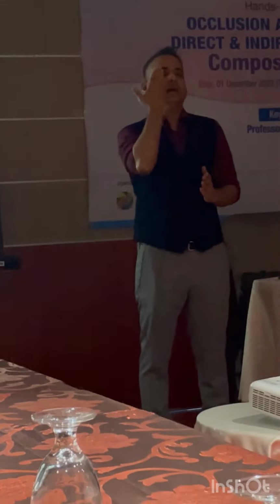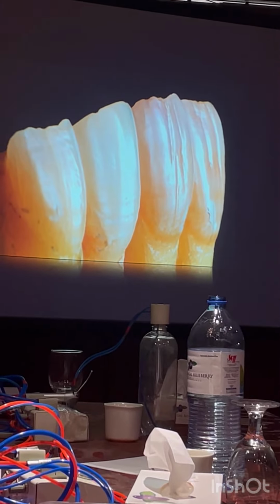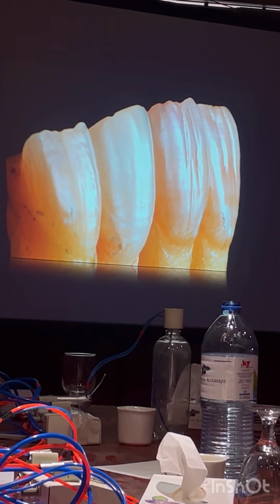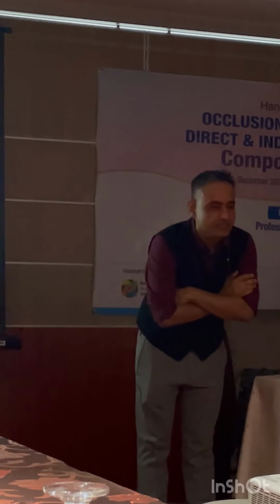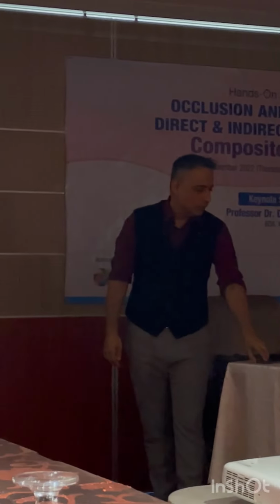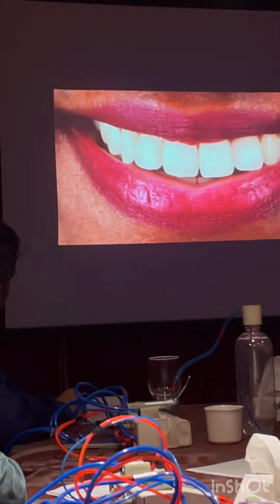One is this view. I will come from this side, proximal view. Okay? Other one is 12 o'clock view. So I go behind the patient and I check. And the other one is 3 o'clock position. So 3, 9 and 12. You cannot see anything from the straight. When I look at the patient like this, I cannot see anything.